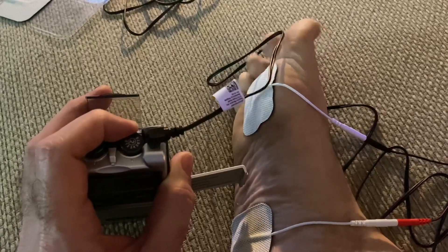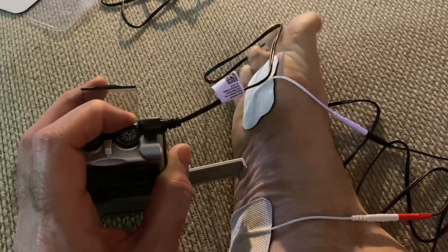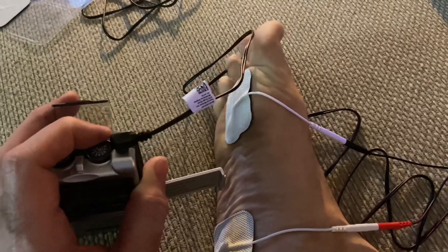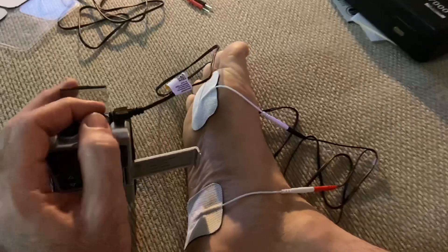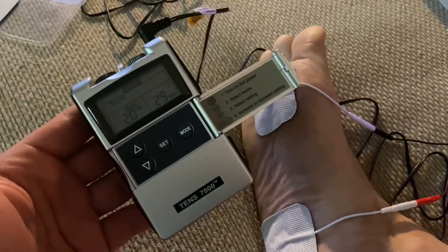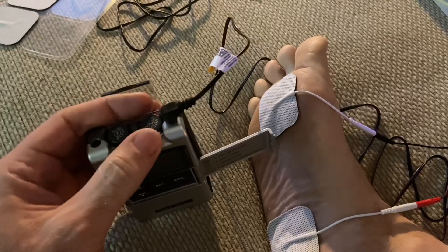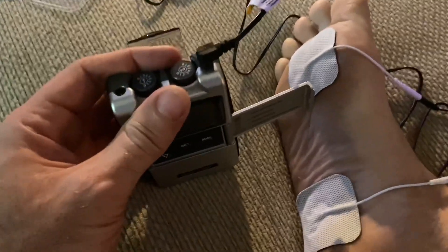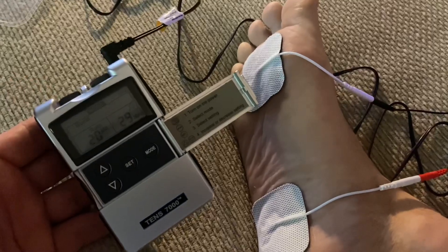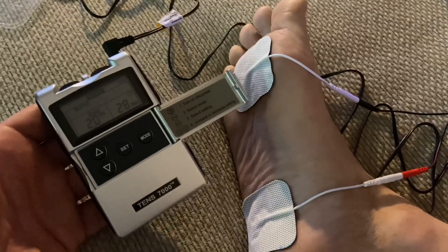So if there's anything you learned — if you ever get one of these devices, I've used it one time before with a different type, but I made the mistake of cranking it up and you don't need to do that. You can't even really use half of this power. I don't even know if it would be cool on your bicep or another muscle — what would it be like on your butt? I don't know. Maybe I'll try it out one day, but I'm not going to show you that. Very cool device.